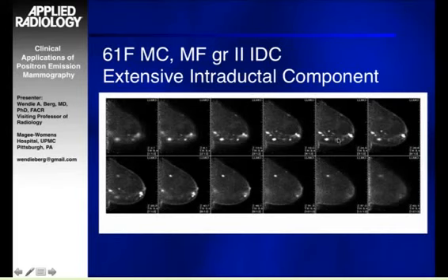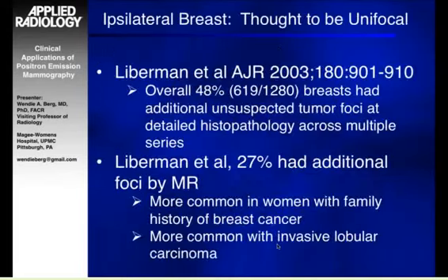And there was yet another focus of invasive cancer in a different quadrant, so this was multicentric as well. And appropriately, this helped to guide the decision to perform mastectomy. It's quite common that there's additional unsuspected disease when we look hard enough. And this is a matter of some controversy, whether we need to find all this or not. And again, we can discuss this if there's interest.